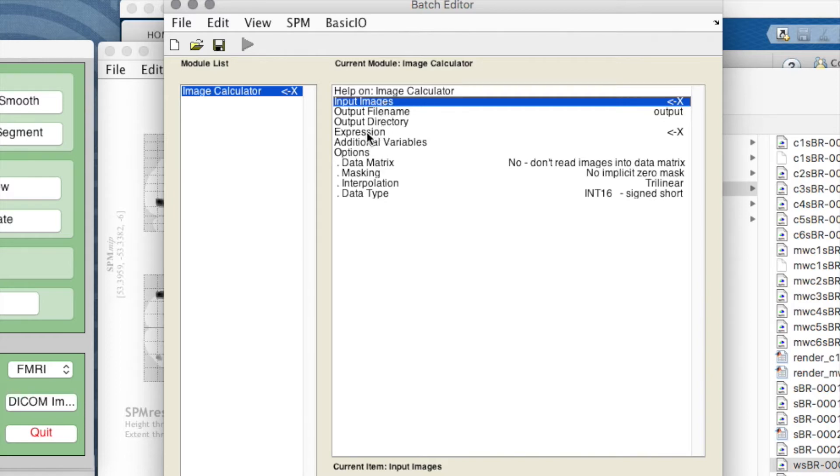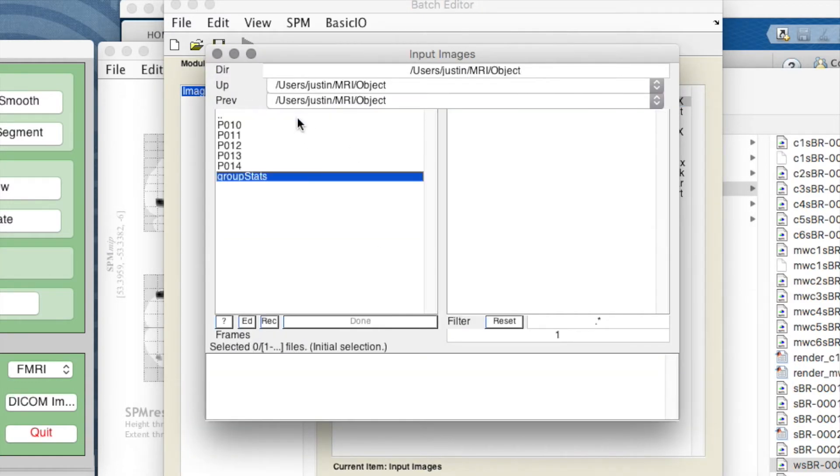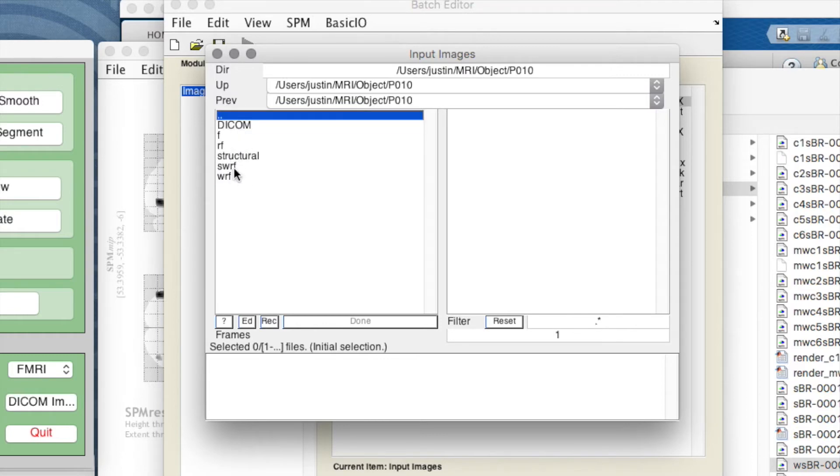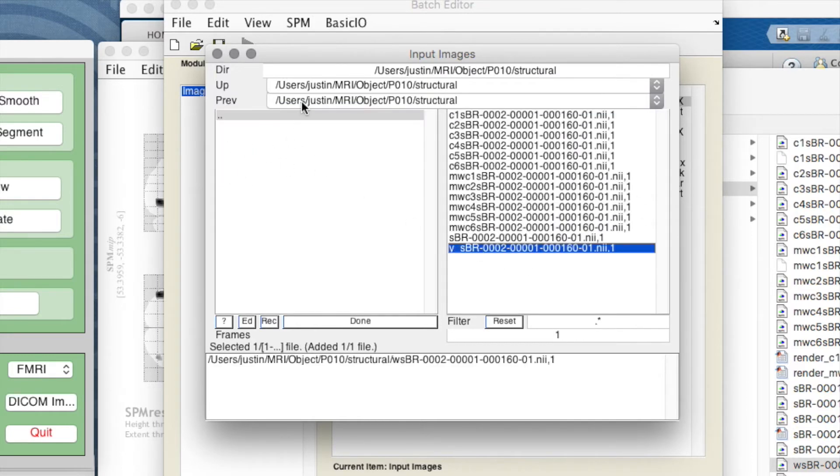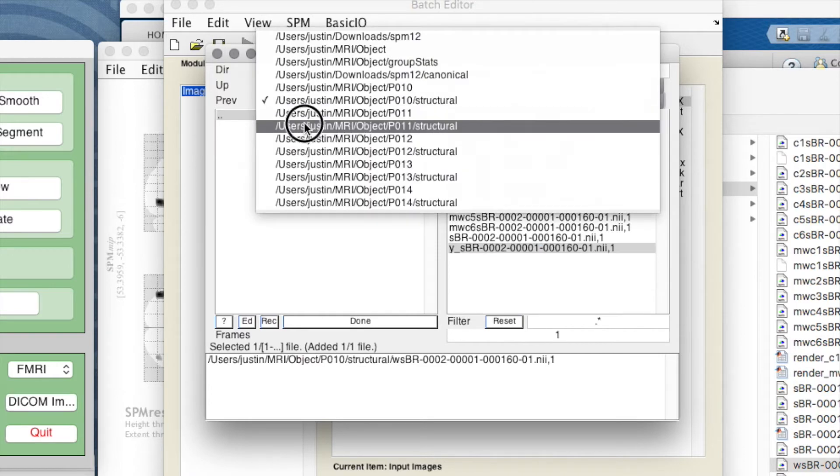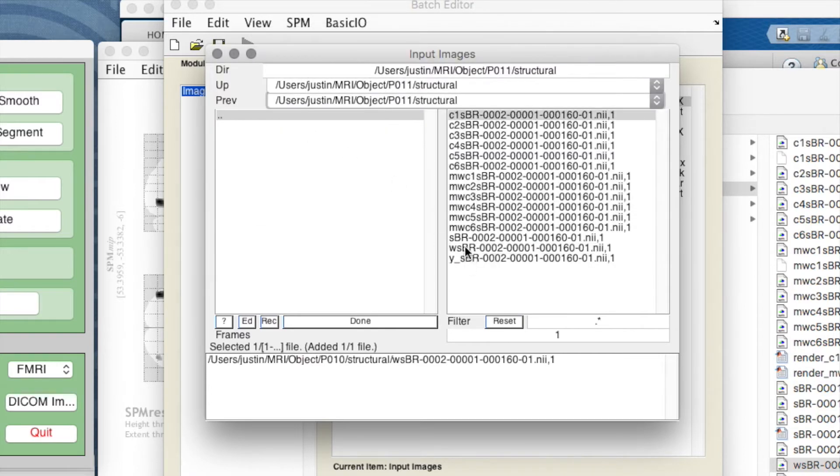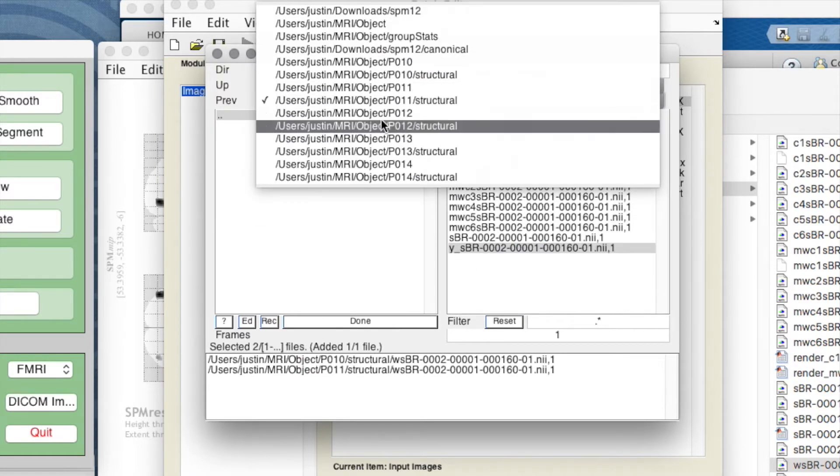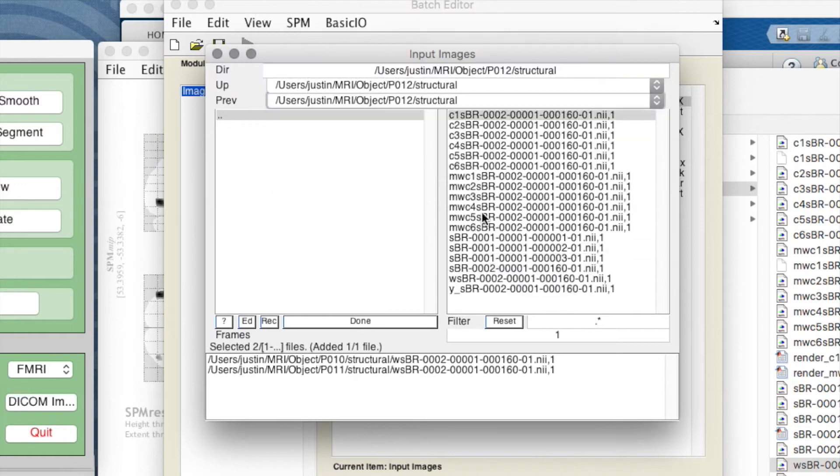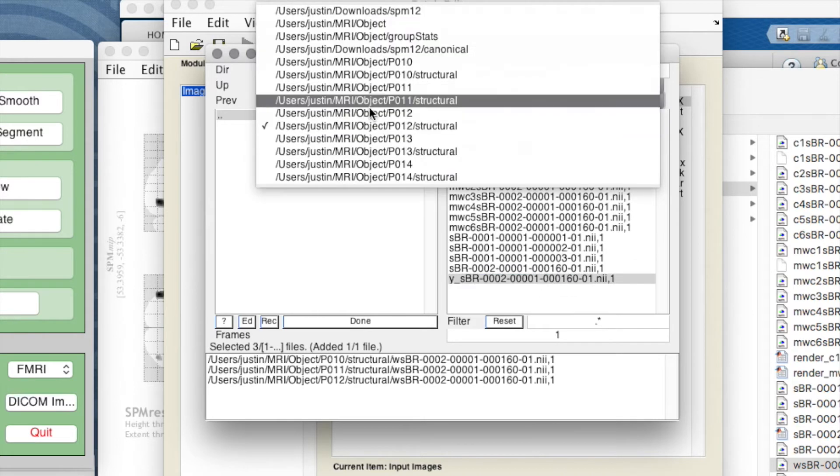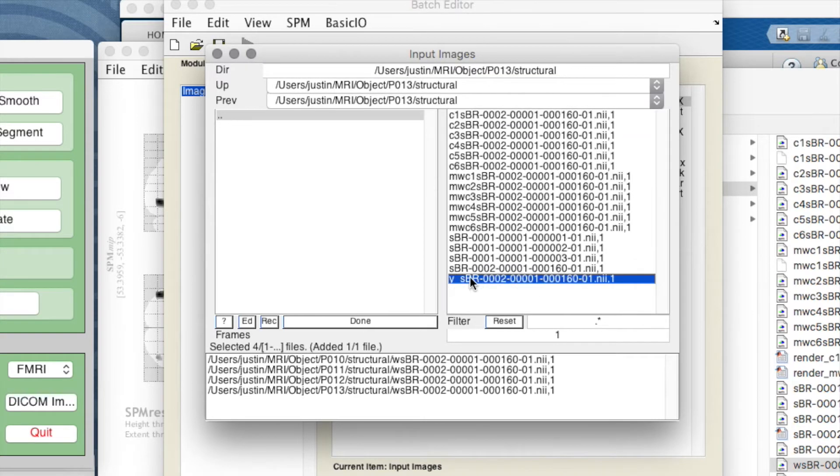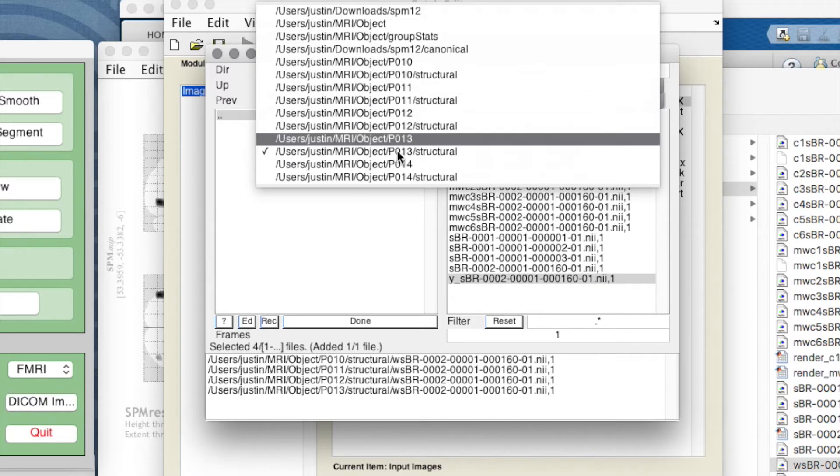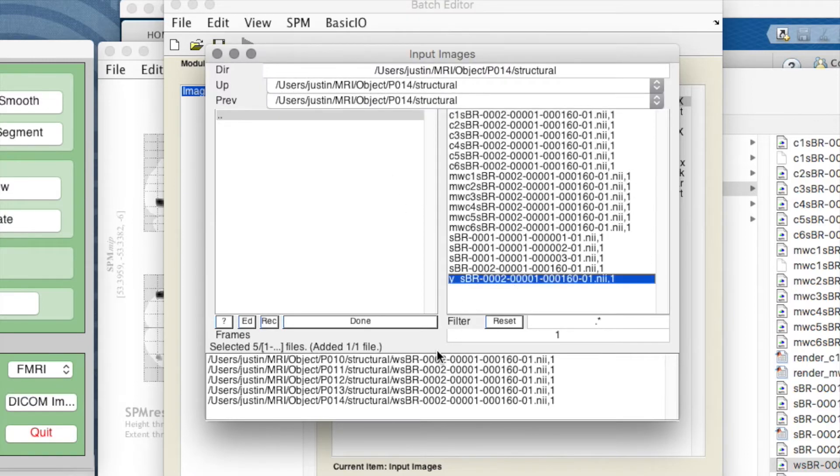The input images are our five structural images. I'll select participant 10 warp structural, participant 11 warp structural, participant 12 warp structural, participant 13 warp structural, and participant 14 warp structural. Just checking I've got the right ones - the warp structural images are 10, 11, 12, 13, 14.